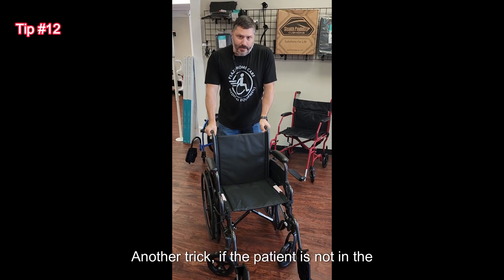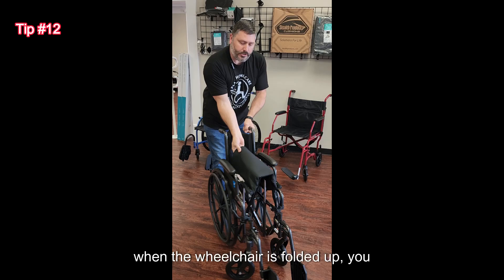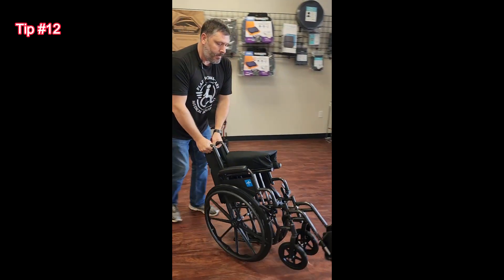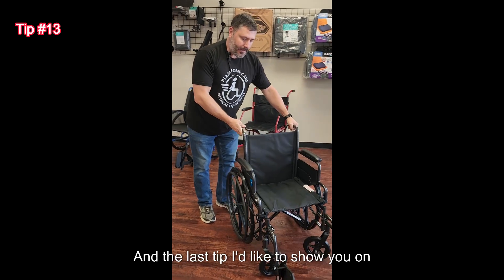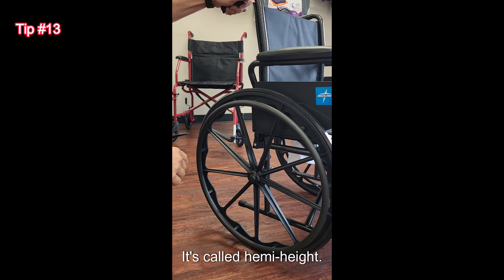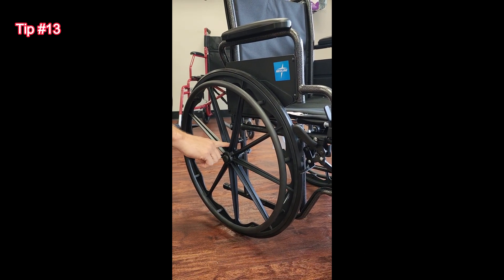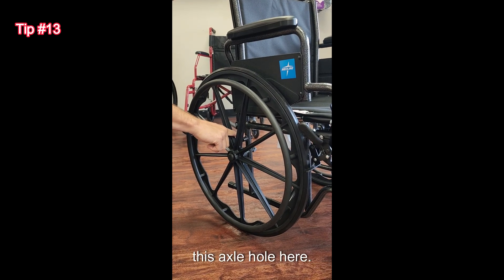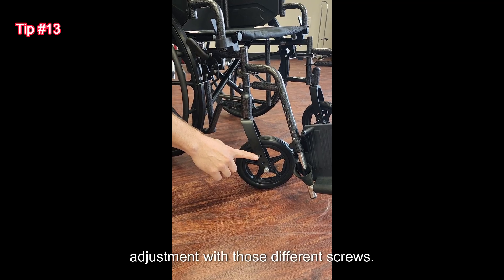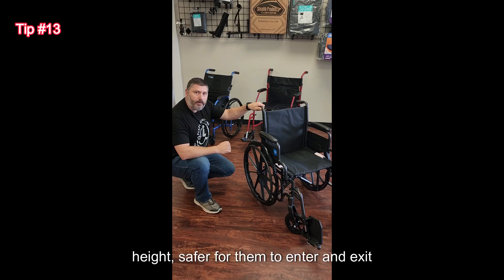Another trick: if the patient is not in the wheelchair and you want to go fast across the parking lot or you're loading it in the car, when the wheelchair is folded up, you can pop a wheelie and be able to push. The last tip on wheelchairs is the spacing of the wheels — it's called hemi height. You can actually lower the height of this wheelchair two inches lower to the ground by removing this bolt and inserting it into this axle hole here. On the front fork, you would have to do the same adjustment with those different screws. That would allow a shorter patient to have the chair at a lower height, safer for them to enter and exit.